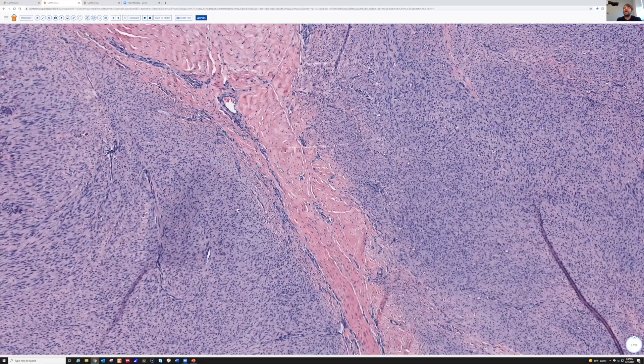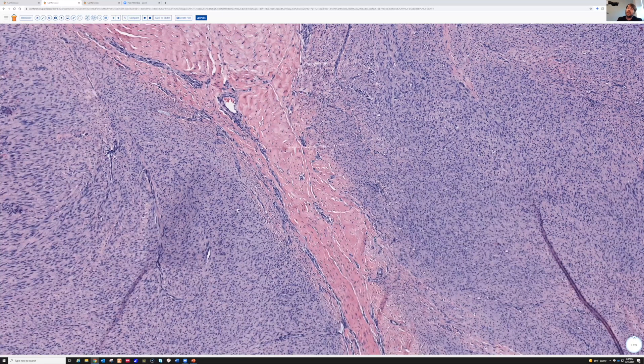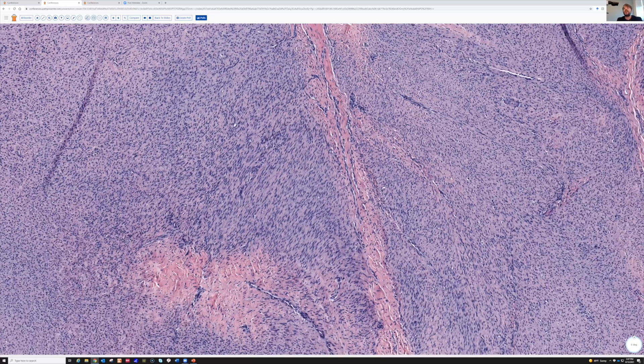So look around at all the areas, and then if you start finding the nice fascicles, you'll know those round cells are just cut straight across here instead of long ways. That's a trick that I think confuses a lot of people.